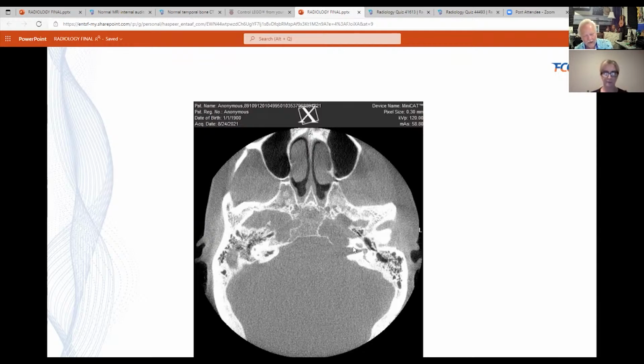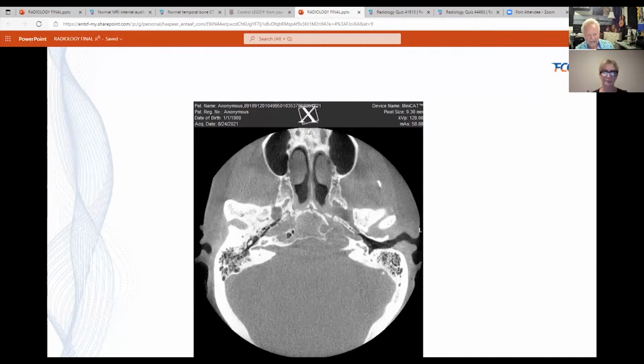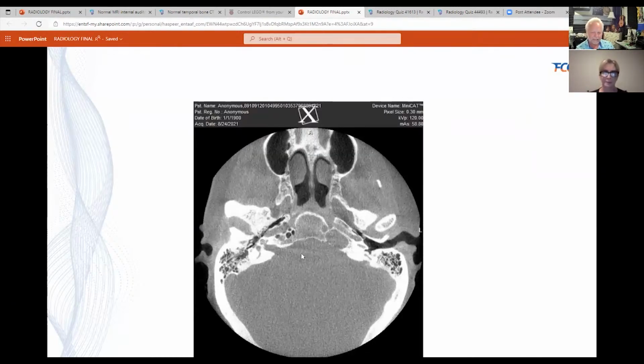And it's a little hard to fully appreciate and understand how that might be affecting the cochlea, because there's a pretty good distance, but we do see it fairly commonly, and it may be causing inflammation of the nerve roots of the 7/8 nerve complex as it comes in here, even though there's really not much pressure. And in this patient, we also got a MRI scan to look at this area, but you can see it looks like a big egg sitting out here.